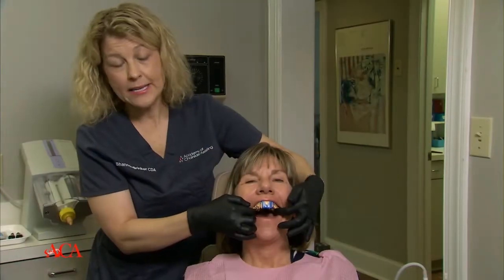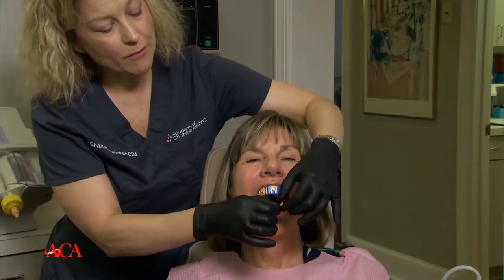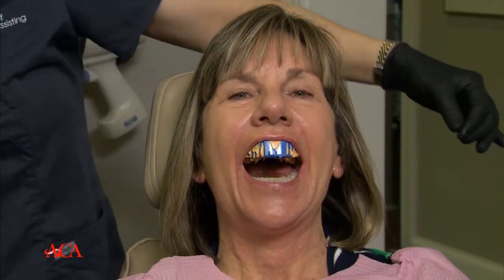So it's been a minute and a half. I'm just going to double check. My timer's gone off, but I also want to make sure that when I pull it apart, it rips really nice and clean. That's kind of my second way to check the impression material.